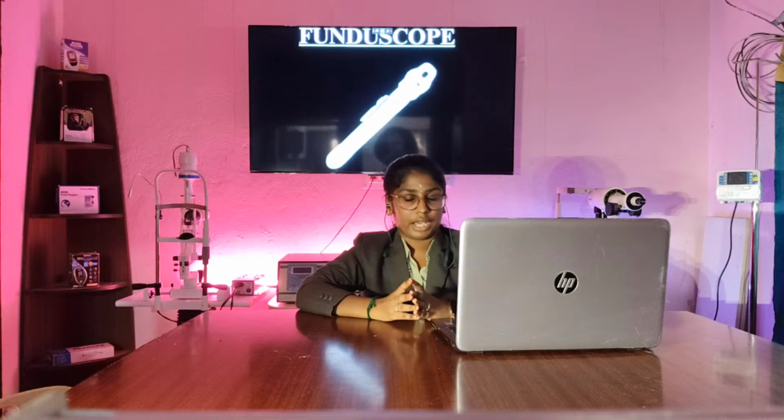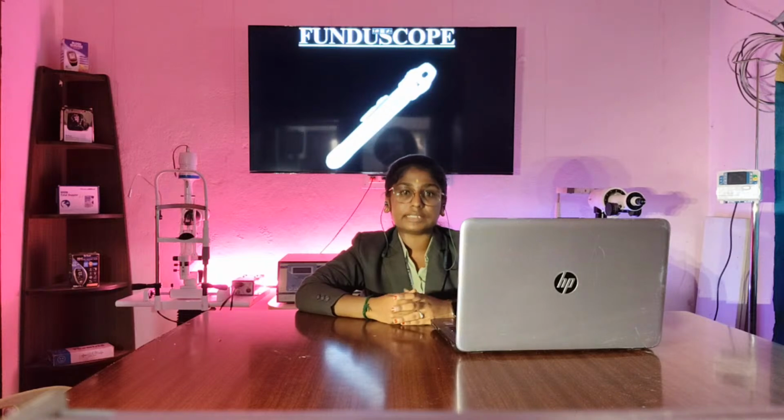So the next one is the fundoscope. The fundoscope is otherwise called an ophthalmoscope. The fundus is the area of the internal part of the eye, in a very deep manner, which consists of the retina, macula, optic nerve, and the internal part of the fovea. These are all comprised in the fundus. So that particular area is responsible for central vision also. When light is entering into the eye, the person may feel blurriness, or can feel blindness or color blindness. So at this time, the fundoscope will be helpful to view the internal part.